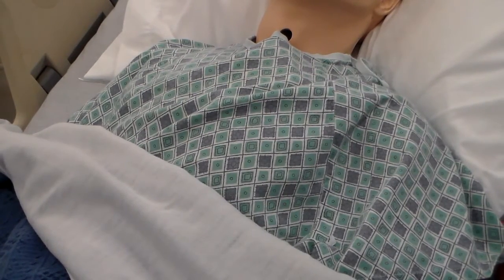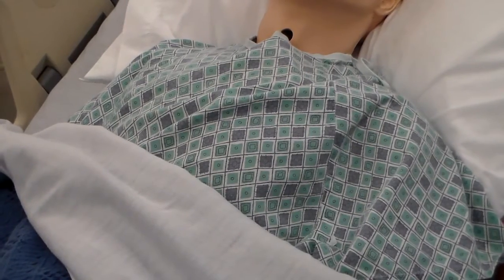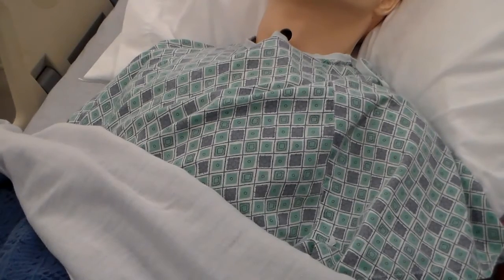Alright guys, this is skill 1.24, assessing the lungs. So for this, we're going to start off with the basics of assessing the lungs. And as we continue on in your nursing student career here at Alfred, we'll add on to it. But right at this moment, we're looking for proper stethoscope placement and whether you can hear lung sounds and whether you're hearing good or bad, okay? Or what you think is good and bad, okay?